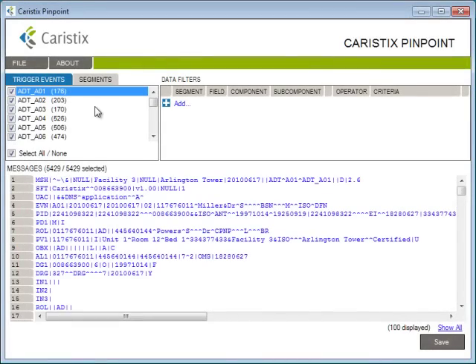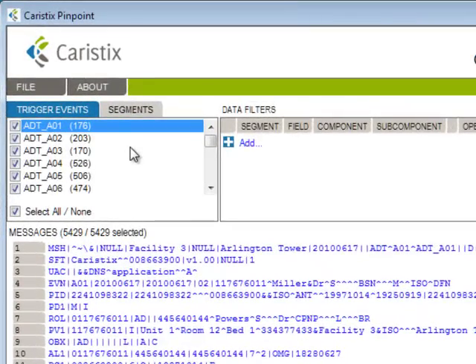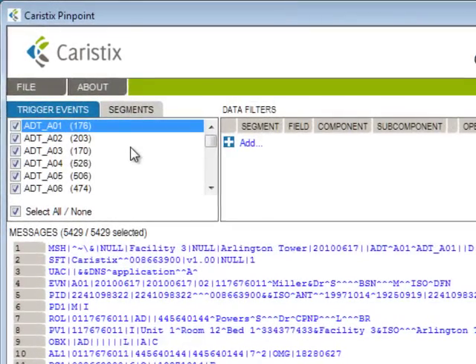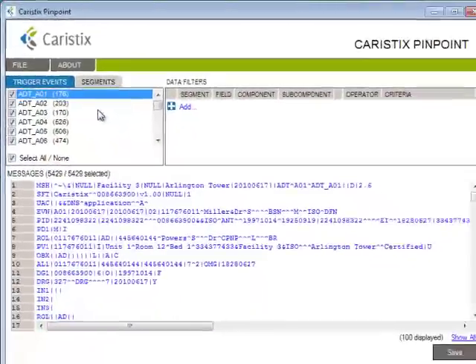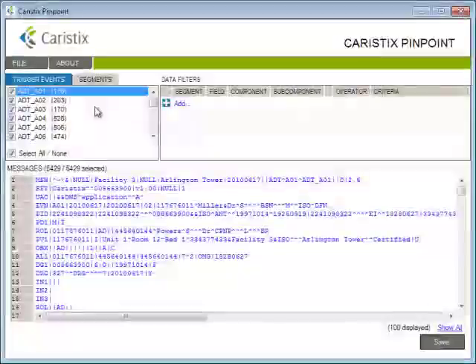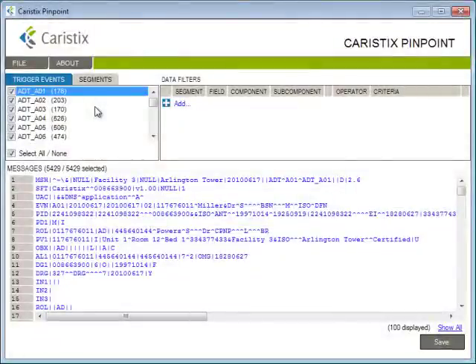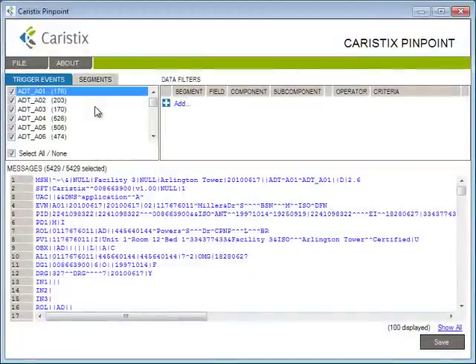Pinpoint is a powerful new tool designed for HL7 interface engineers and analysts. Pinpoint does one thing, and it does it right. It helps you filter message logs when you're troubleshooting HL7 interfaces, so you can spend less time hunting and scrolling, and more time getting the data flowing the way it should.